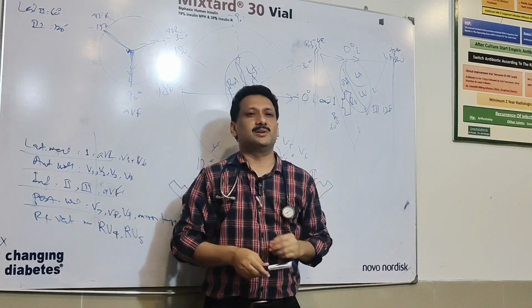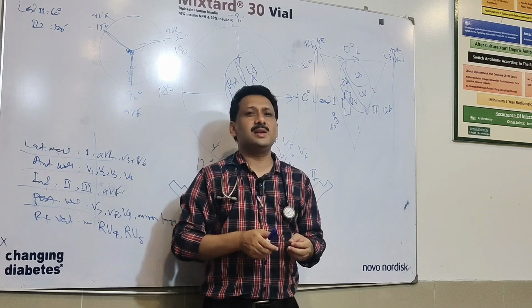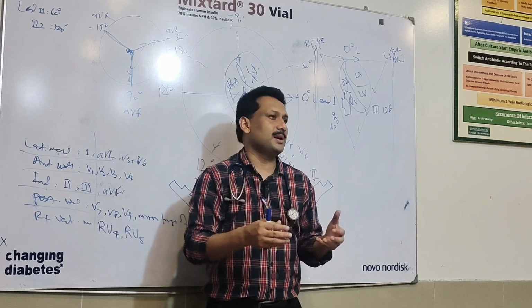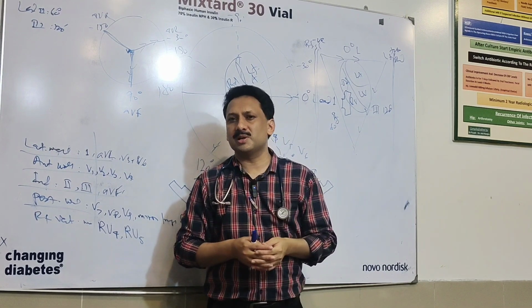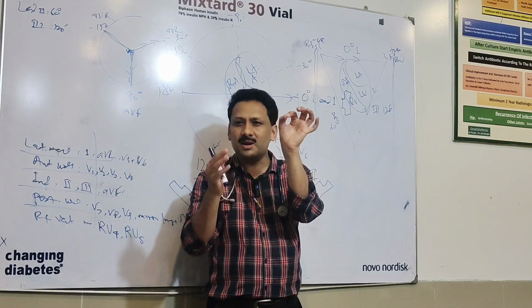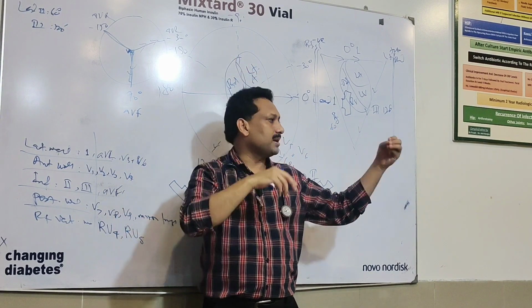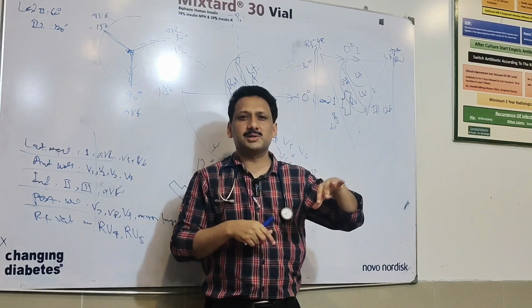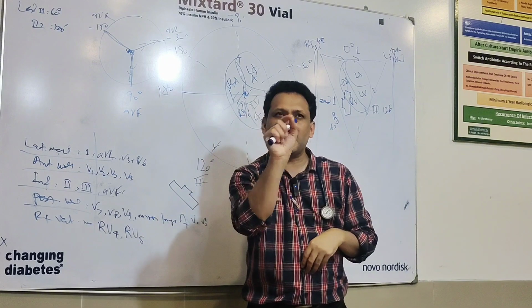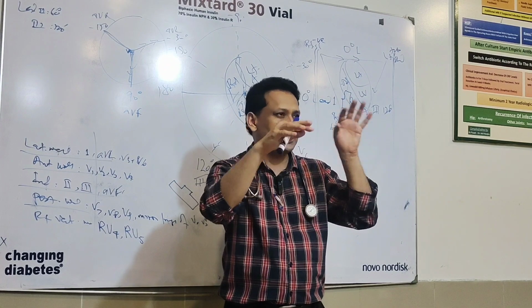Now the next question, which arises in the mind of a beginner and a person who is seeing an ECG for the first time, or maybe for all those who have seen it multiple times but do not have a good core concept. The question is: why do these lines, even in a normal person, sometimes go in certain different directions, sometimes in altogether other directions, although the person has a normal heart, but in different leads, as you would be seeing in the waves which make up the ECG waveforms.